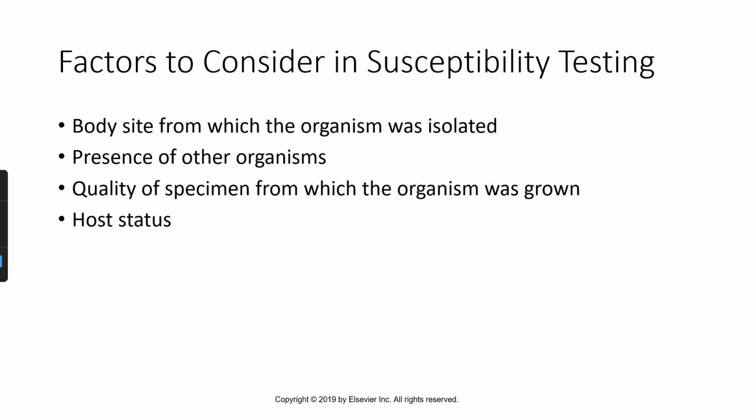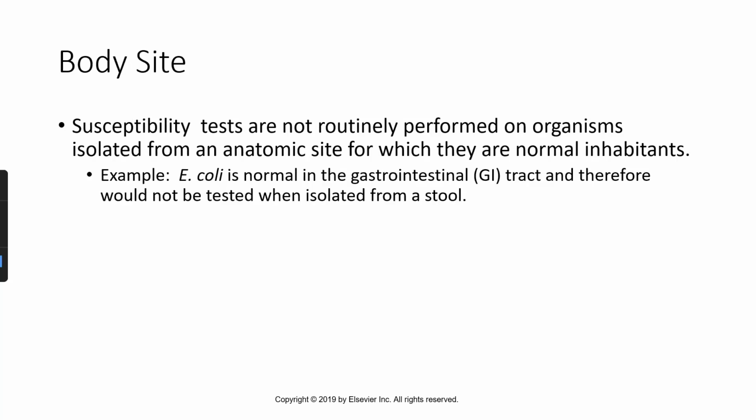So factors to consider in susceptibility testing: the body site from which the organism was isolated, the presence of other organisms, so whether we have a pure culture or if it's mixed flora, the quality of the specimen from where the organism was grown, and the host status.